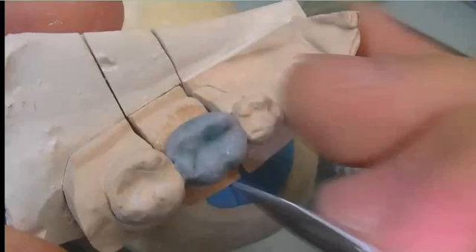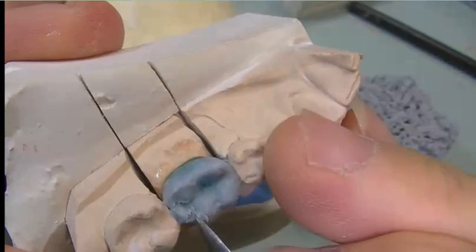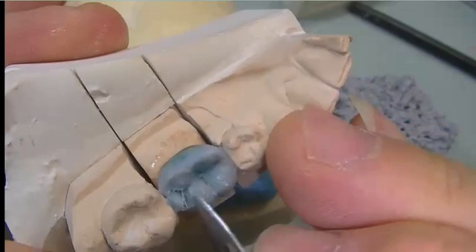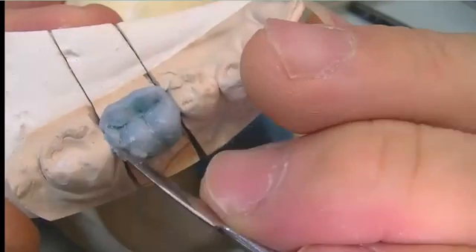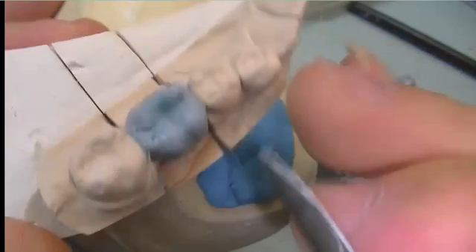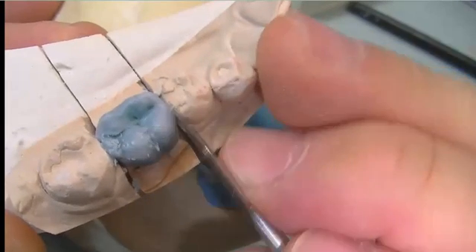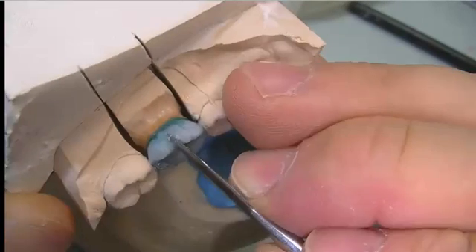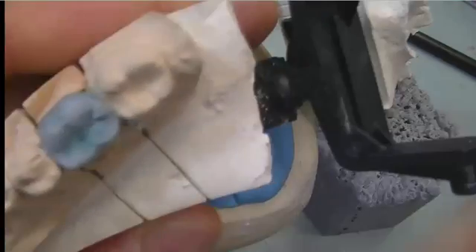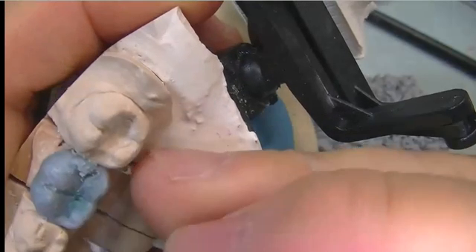We do a little bit of carving now, as it might be high in occlusion. All we have to do is close the articulator and see if there are any high marks. We carve some of the excess wax away, keeping in mind we have to maintain a certain proportion of where each cusp should be.